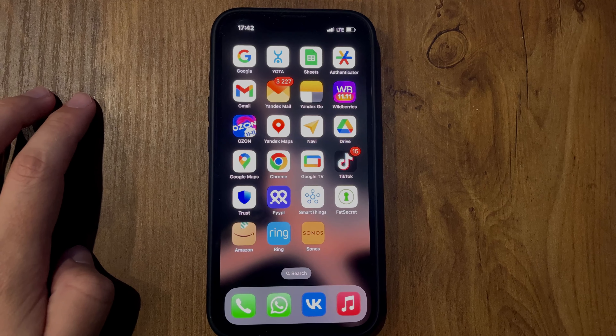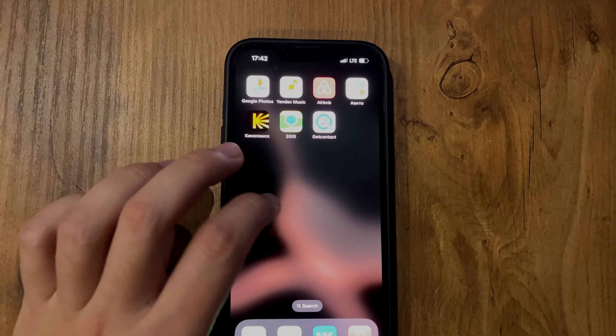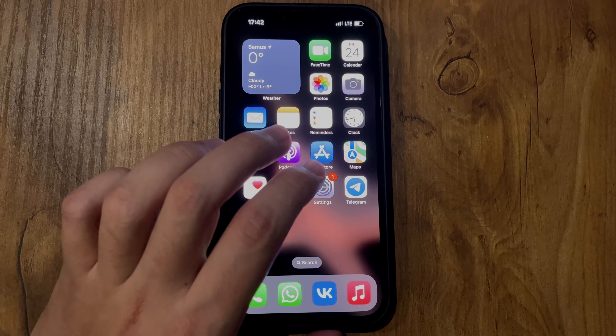Hey everybody, here on the Mr. Octopus YouTube channel. Today I will tell you how to connect Oticon Hearing Aid to iPhone. Let's go. Open Settings.